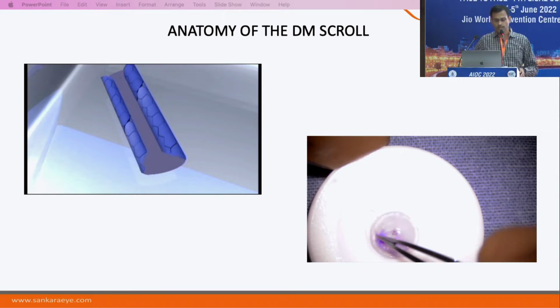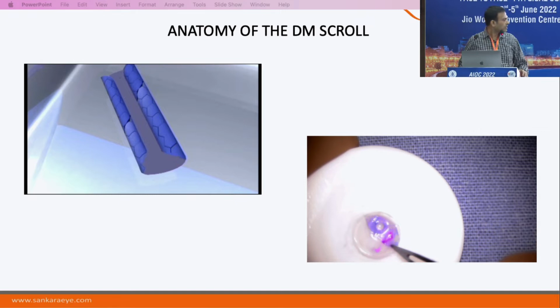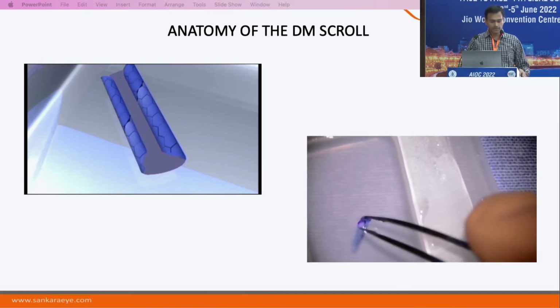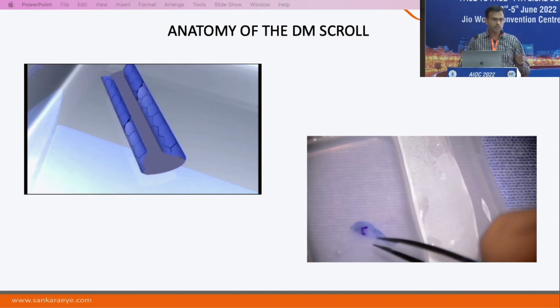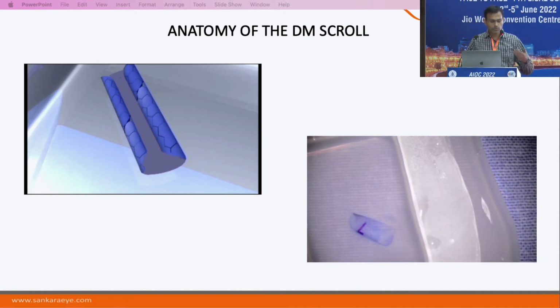So here you can see, like in a DSEK, if you want to put a taco fold, I am putting a taco fold and putting it into the saline. The endothelium is actually inside, but the nature of the DM is such that you see it flaps open and the endothelial side comes out. This is the biggest problem we face, because in DSEK the endothelium is inside and safe, whereas in DMEK it's outside. That's why there is so much loss.